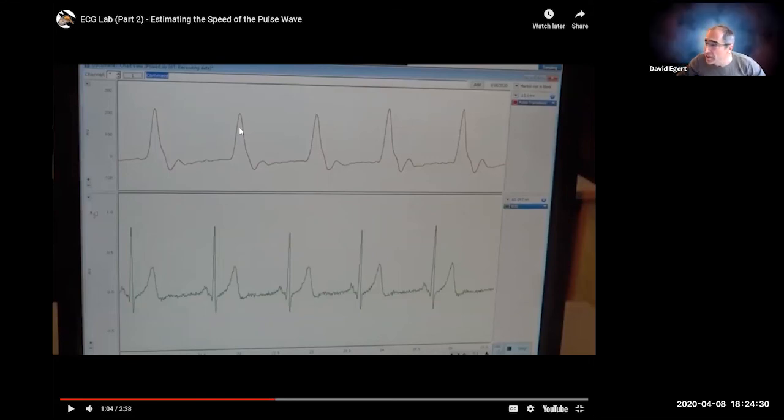So this is an actual mechanical movement that is being detected by the transducer, and the computer's displaying it this way. So it's a very different thing. We have printouts of this as well for you to work with in your lab write-up. Make sure you really think about how the EKG is electrical activity of your heart. This pulse transducer is just the movement of your finger as the pressure at your finger goes up and down with your pulse.